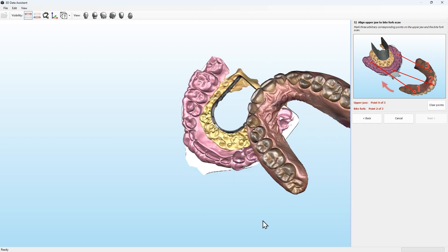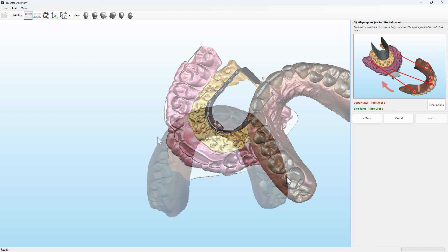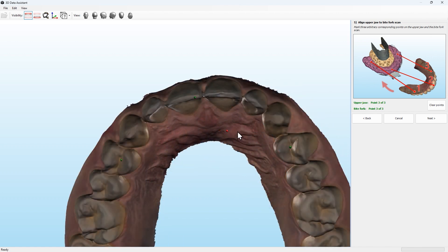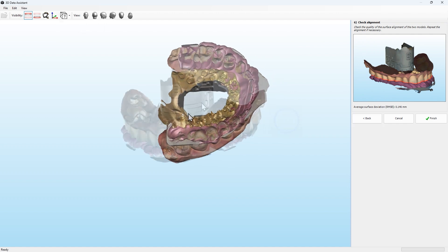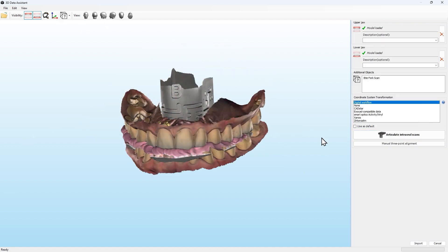Therefore you have to select three points on the bite fork scan, and then the same three points on the upper jaw model. By aligning the individual scans together, they can be positioned correctly in the virtual articulator and used for virtual functional analysis.